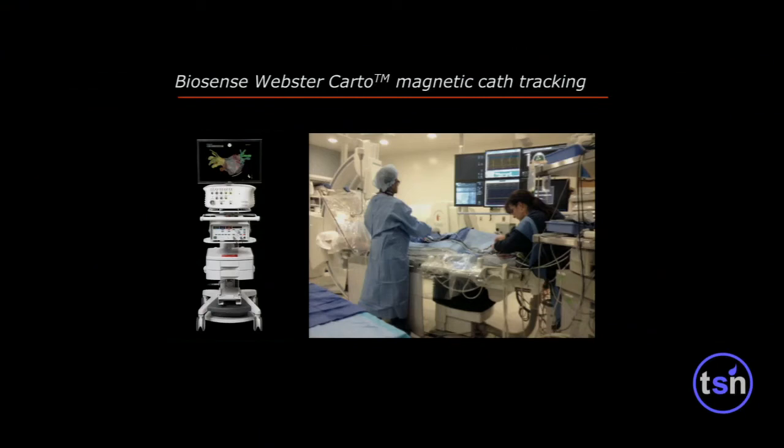And then we're using this to direct the biological therapeutics. So if you have stem cells, you want to know where to inject them in the heart. We believe that inflammation is a great visual cue of where to inject. So you have a nice detailed map of the most recent inflammation from the recent heart attack. You can then inject at the boundary, for example, and that's where you get the most bang for the buck by injecting your cells. So we've been using that 3D information that I showed you in a magnetic cath suite, shown here.